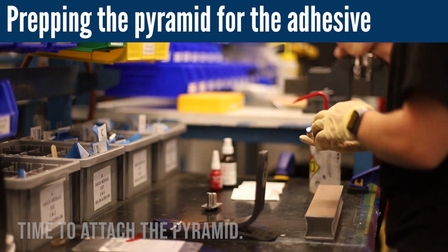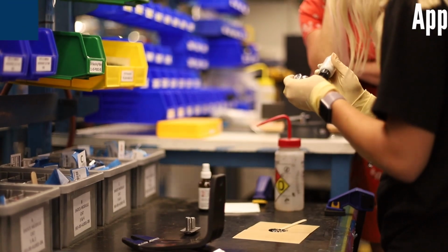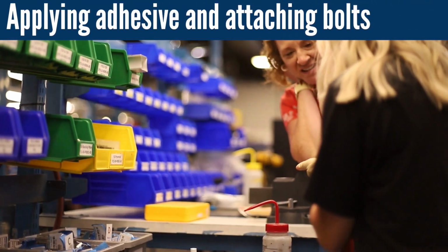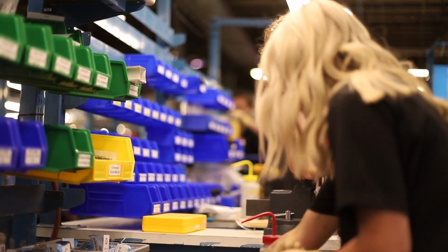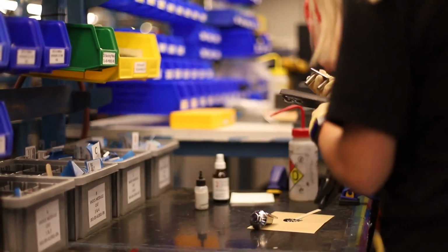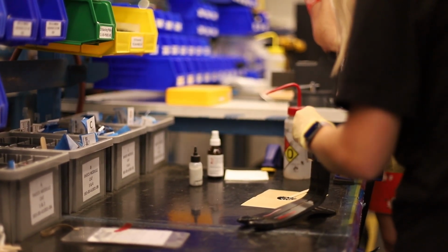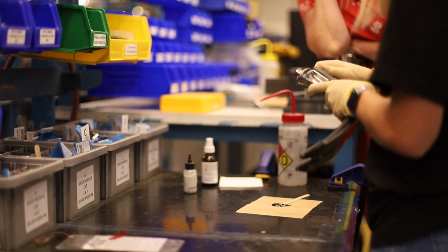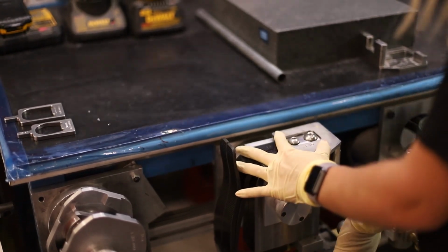So the adhesive. Adhesive, yeah. That's glass? Little bead kind of. And what does that do? Kind of like a spacer. And then it makes your vacuum plate all straight.